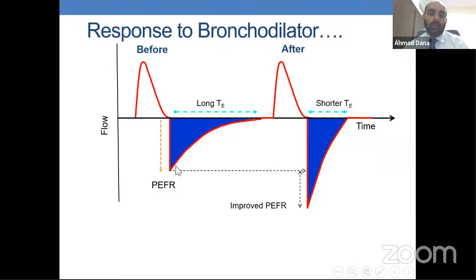So you realize you can examine the baby clinically, you feel there is some wheeze. So you understand that the baby is having bronchospasm. Give him the bronchodilator. So you check the response to the bronchodilator. So this is the beauty, one of the very important benefits of the graphics, the response to treatment, especially the bronchodilators in bronchial asthma patients.